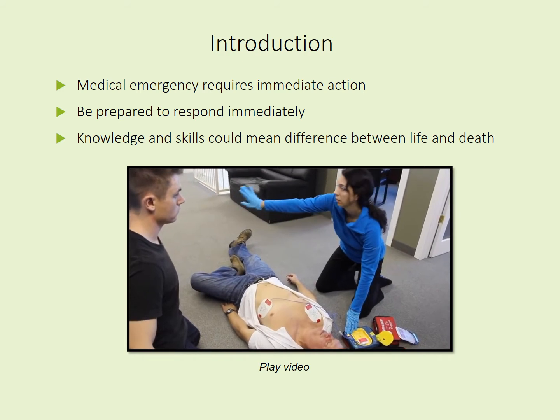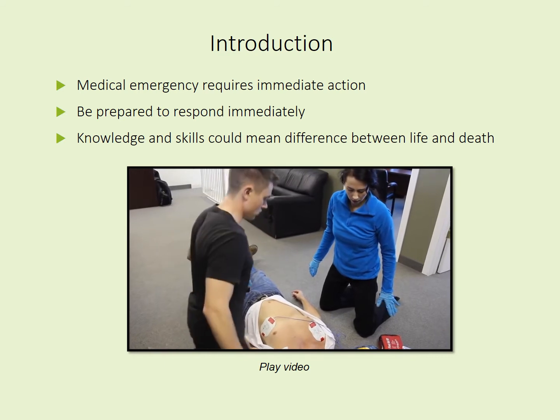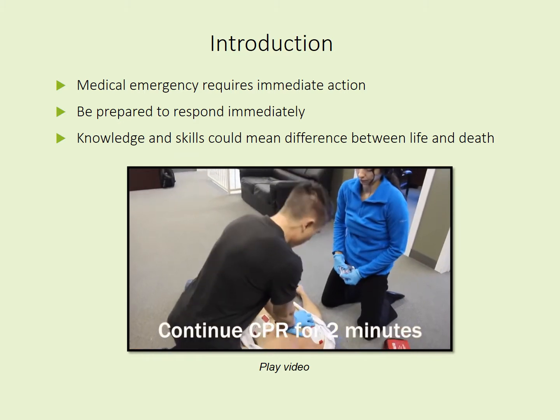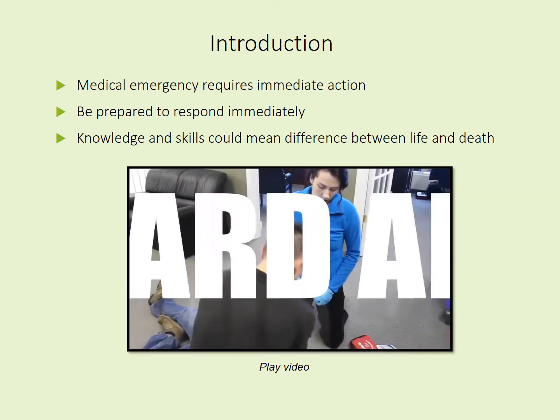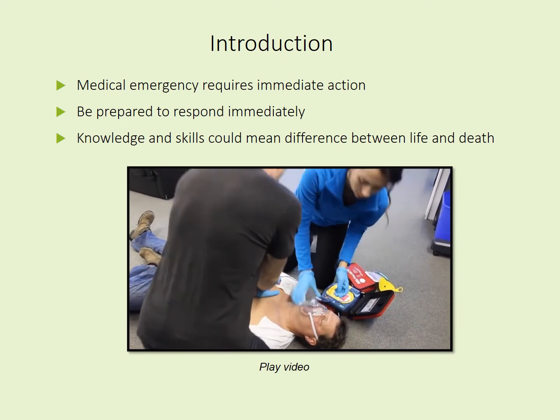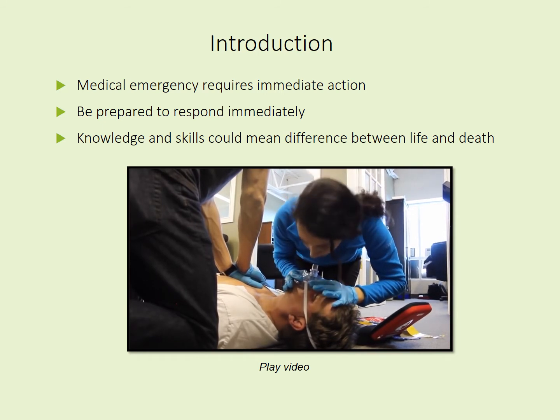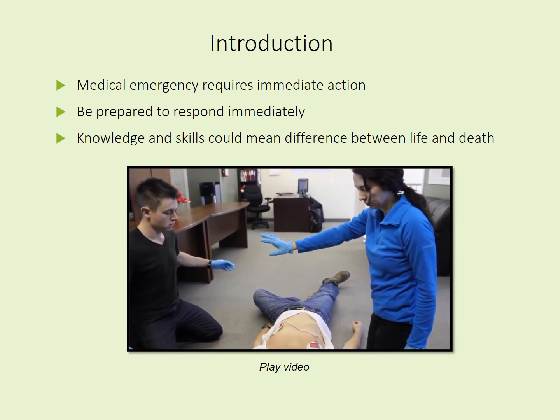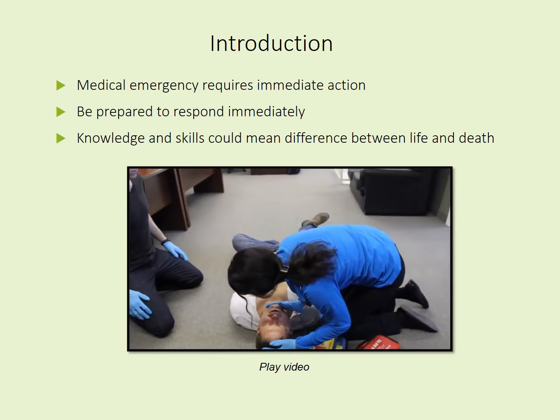Okay. Everybody stay clear. Press the flashing orange button now. Shock delivered. Be sure emergency medical services have been called. It is safe to touch the patient. Begin CPR. No one should touch the patient. Shock not advised. Okay, I'm gonna check for breathing. It is safe to touch the patient.